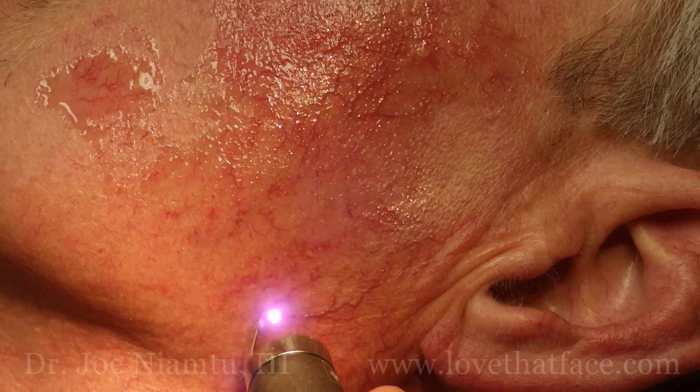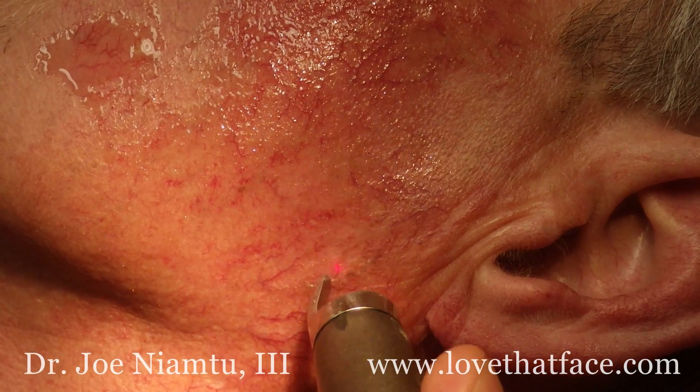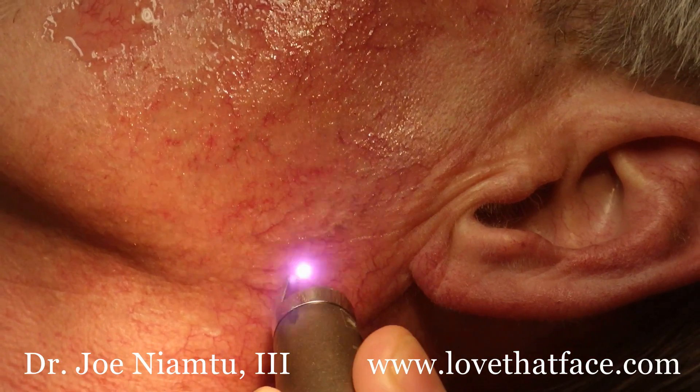All right, so we're going to treat some of these lesions, and you can see that it causes the blood to boil within the vessel, and as we trace the lesion, it pretty much just disappears.